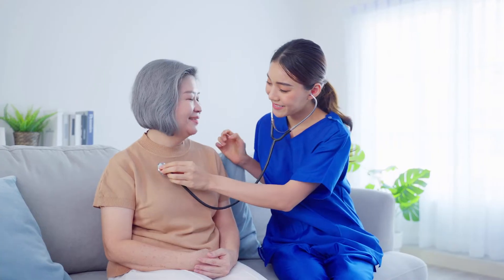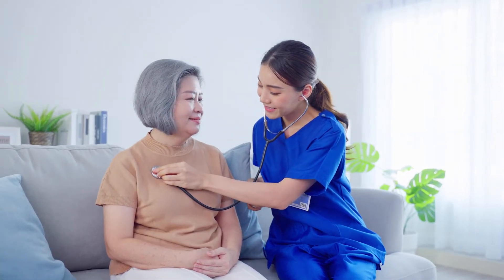Then take a look at your chest piece and make sure you have the right one for what you're trying to do. If you're listening to lung sounds or just basic heart sounds, you want the diaphragm. Give that a light little tap and you'll hear it pretty loudly in your ears — that confirms it's active. When you put it on the patient, you know you're listening for the right things.